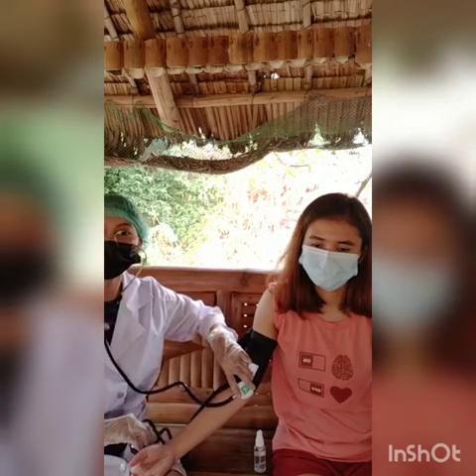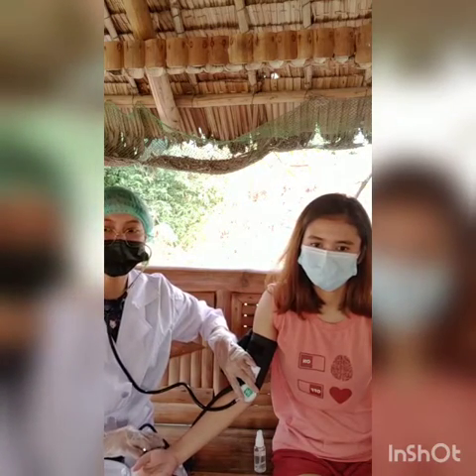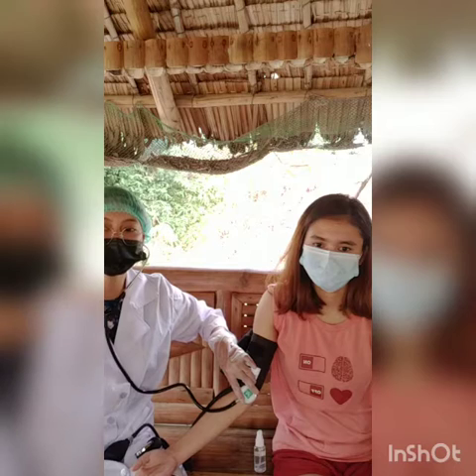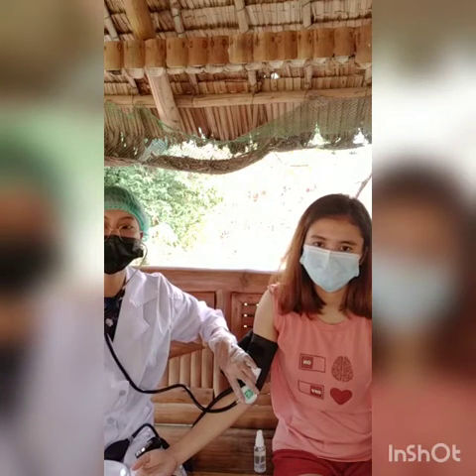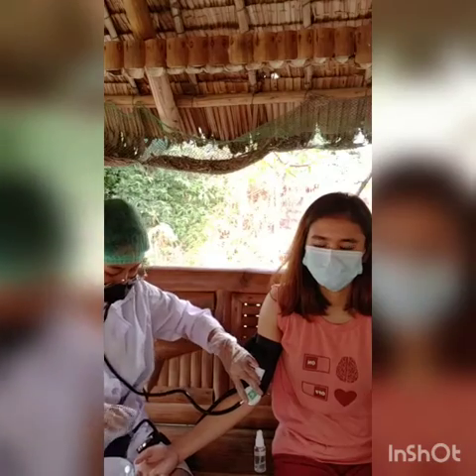And then after that is pump the pressure 30 millimeters of mercury above the point in which systolic pressure was palpated and estimated. And then open the valve on the manometer and allow air to escape slowly.